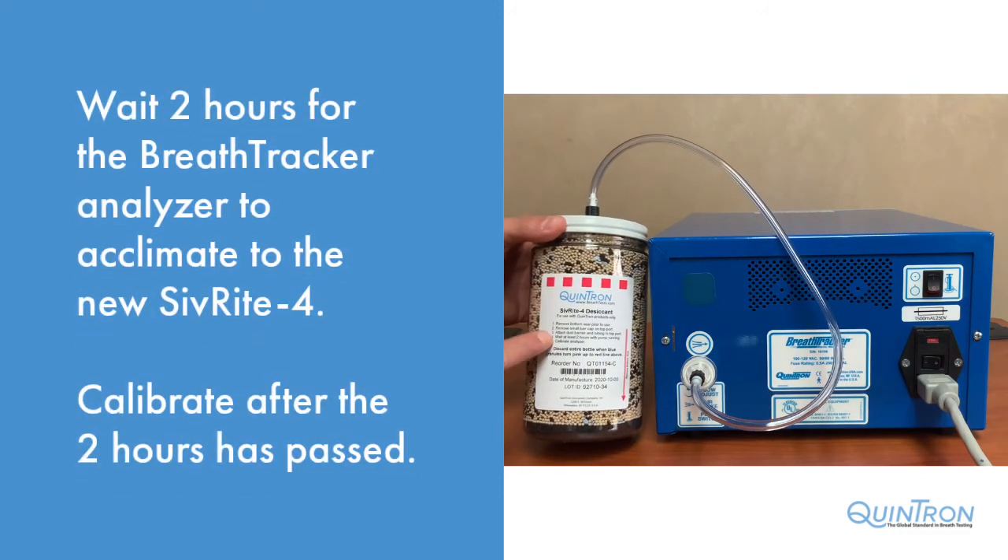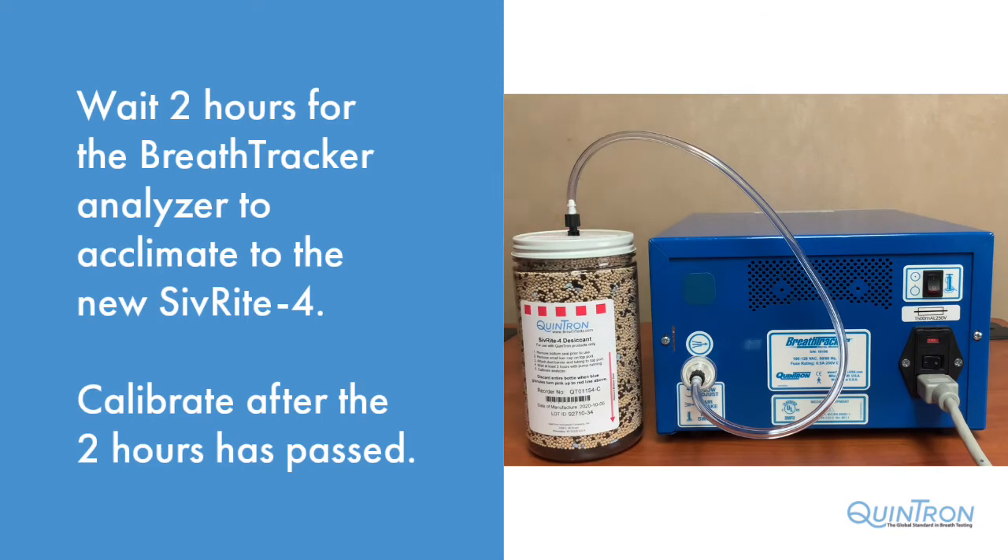After the pump is on, you will need to wait at least two hours while the pump is running to allow the breath tracker to acclimate to the new Sivrite 4 bottle. After the two-hour acclimation is complete, you can calibrate the analyzer and then run patient samples.